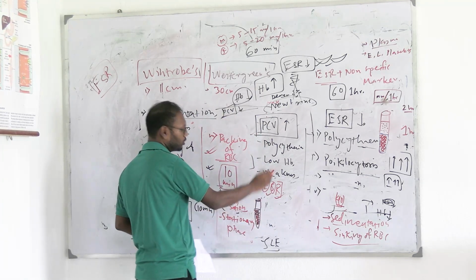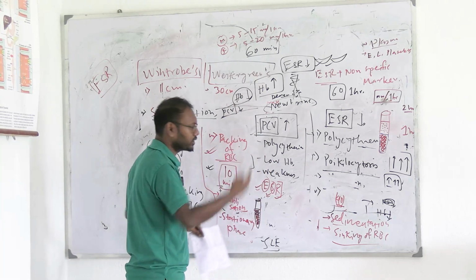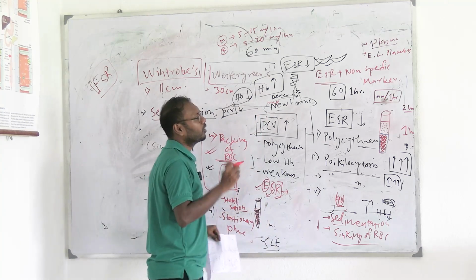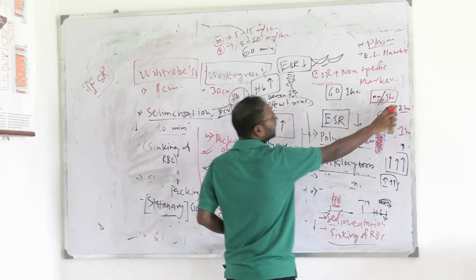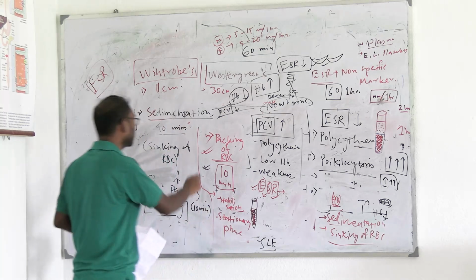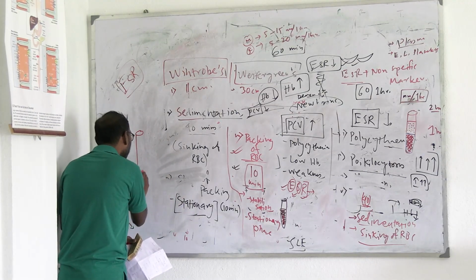So we have talked about erythrocytes. We have talked about sedimentation. What is sedimentation? What is the basic process? Now we will move on to why it is called rate. What does rate mean? We have already talked about various measurements, like calculating after 1 hour, after 2 hours. Since this sedimentation is happening, now consider two different persons.